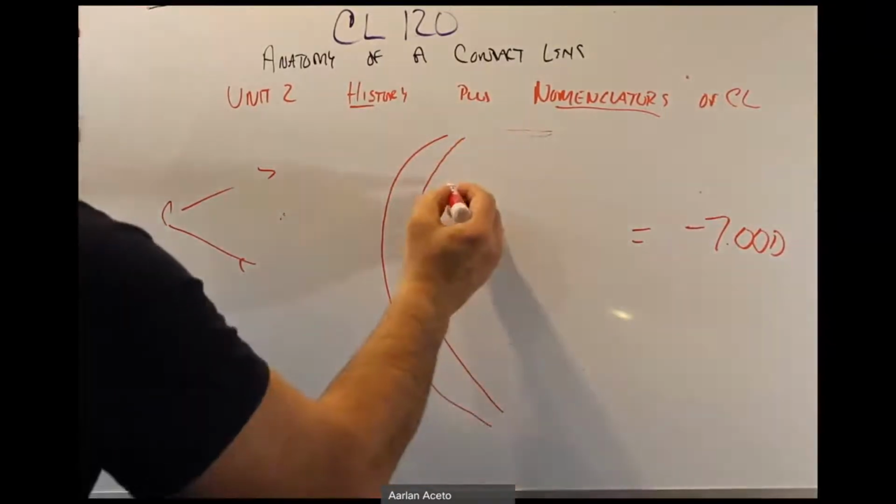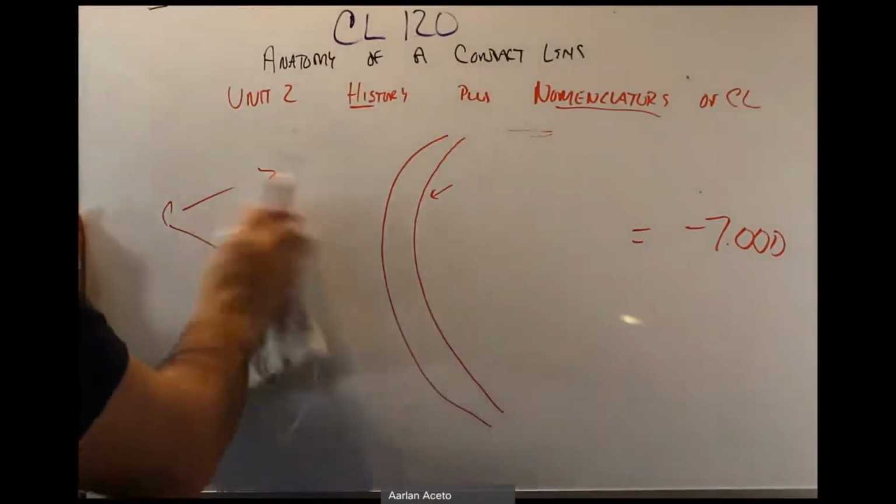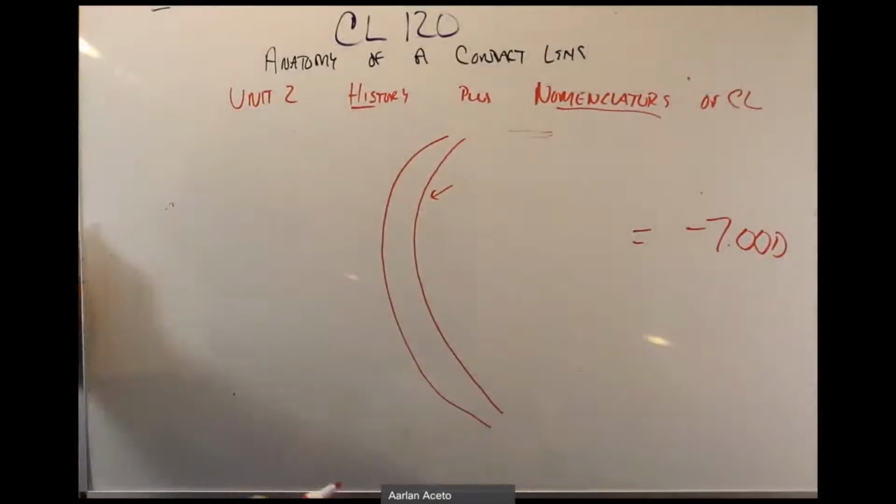Now instead of powers like a -8 on the back, we're doing lenses that are going to match approximately the curvature and shape of a normal human cornea. And remember, the overall refractive power of a normal, quote unquote, average eye is around 60 diopters.